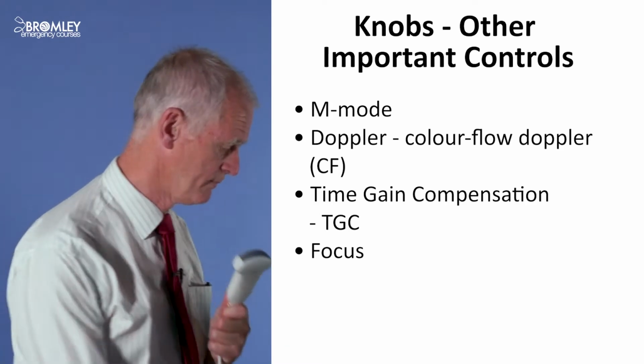Here's a transducer. The magic of the ultrasound machine is the crystal. Now, the world is changing a little bit, but until very recently, every ultrasound machine worked from these piezoelectric crystals. Arrayed across here are probably 128 or possibly 256 of these crystals. Each of these is connected to the computer, and the computer sends an impulse to each of those crystals, makes it vibrate, and when it vibrates it produces sound.